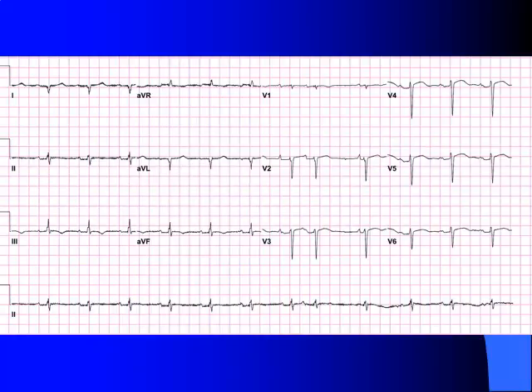Okay, moving on. On this particular EKG, we're going to do the same thing. We'll find our most equiphasic lead, which again appears to be lead 2. Lead 2 running perpendicular is lead AVL. Lead AVL is negative. So our axis is 150 degrees.